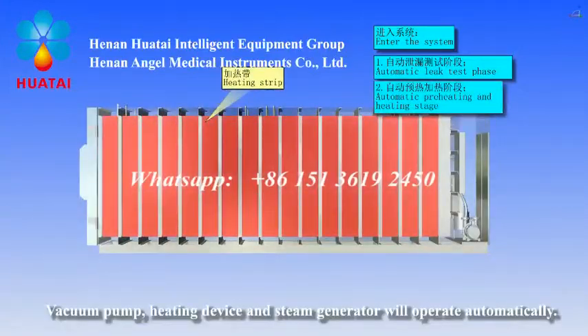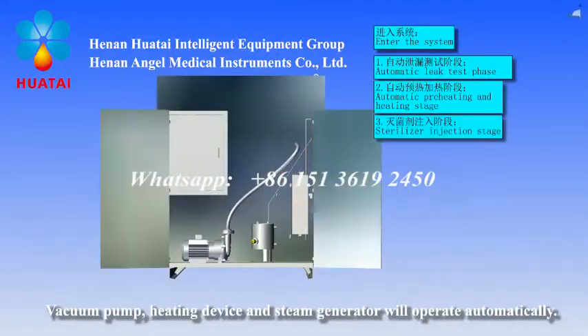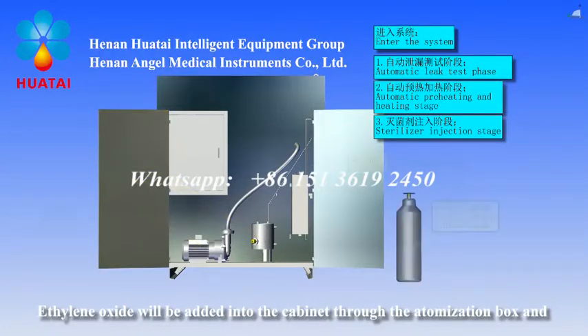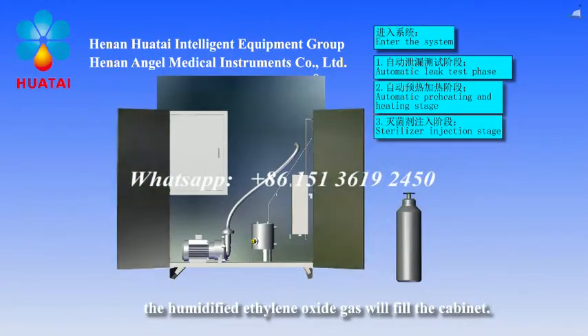The vacuum pump, heating device, and steam generator will operate automatically. Ethylene oxide will be added into the cabinet through the atomization box and. The humidified ethylene oxide gas will fill the cabinet.